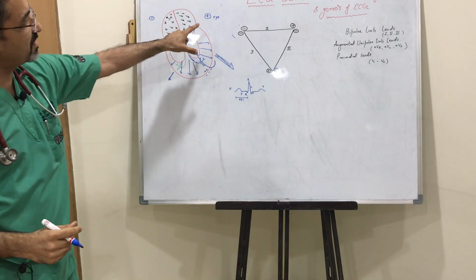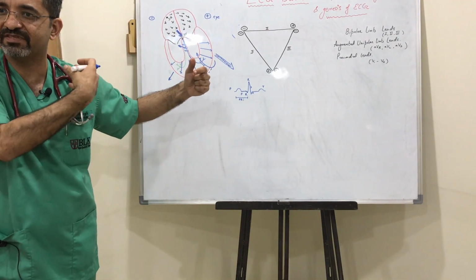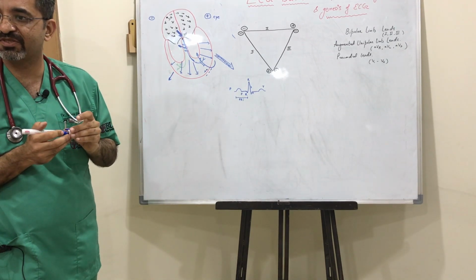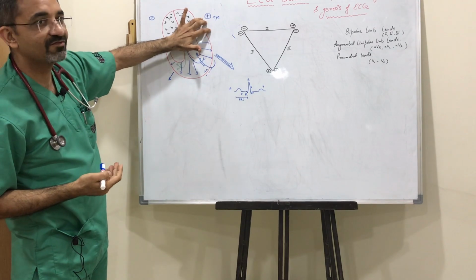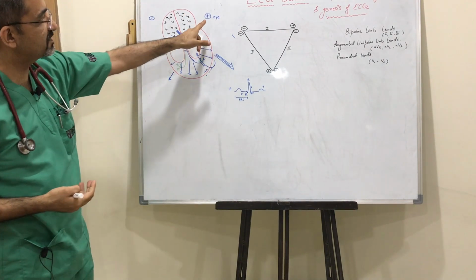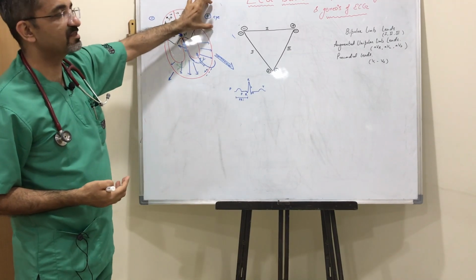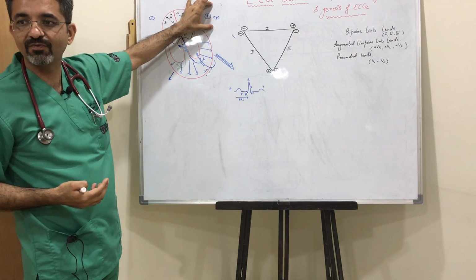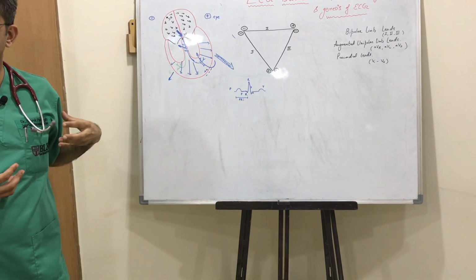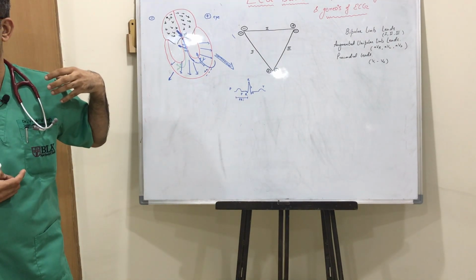Can you see that this eye is looking towards the left side of the heart, the high upper left side of the heart? So we can judge that lead 1 will tell you about pathology happening in the high lateral wall of the LV. You know, this eye is right here. So whenever there is a pathology in lead 1, it will be telling you the exact area, which is the left free high lateral wall of LV, right?